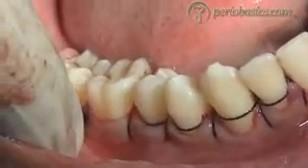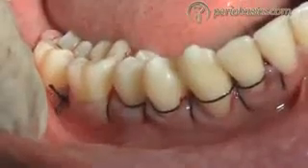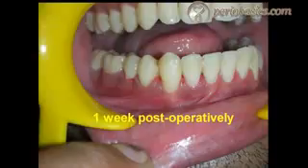I'm putting a continuous sling suture here, and this is after suturing. You can see nicely placed sutures and the flap is properly adapting to the tooth surfaces. This is from the lingual aspect, and this is 1 week postoperatively.